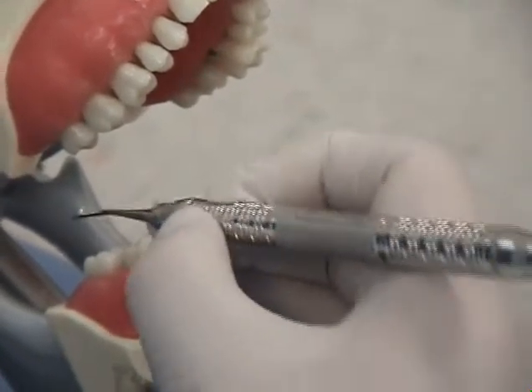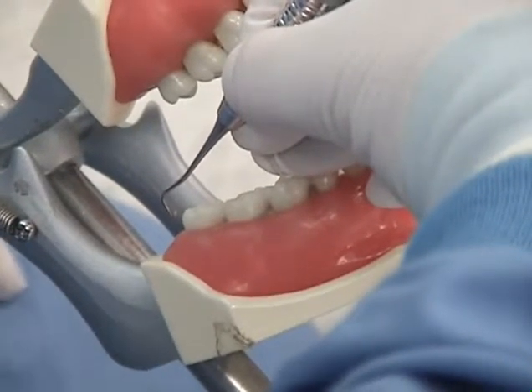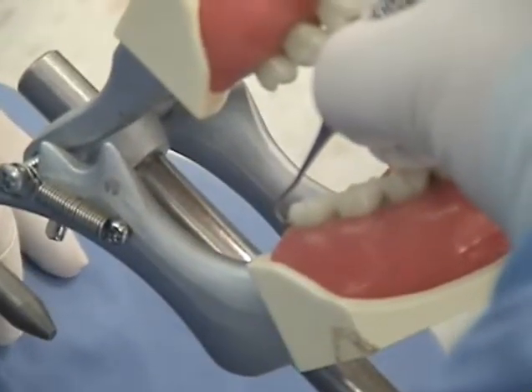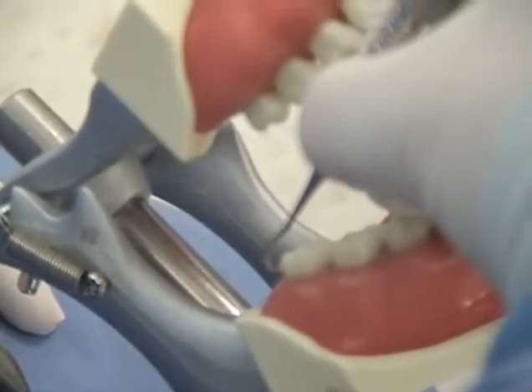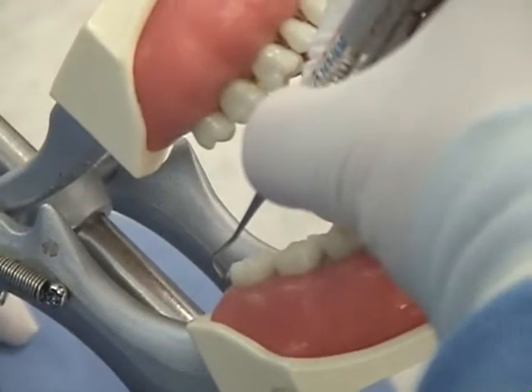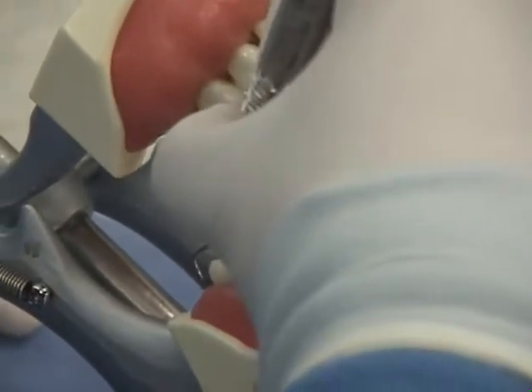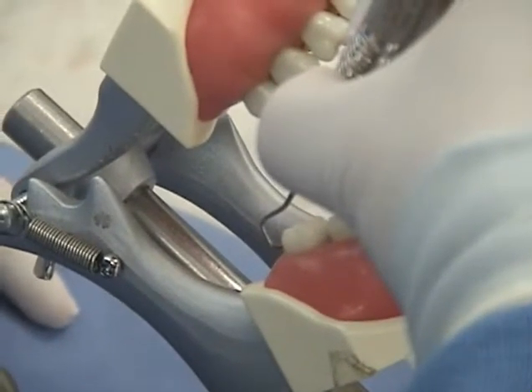Hold the posterior sickle with a modified pen grasp. Begin with the mandibular right posteriormost tooth in the sextant. Establish your fulcrum on the adjacent teeth mesial to your work site. Aim the tip of the instrument toward the distal surface. Tilt the lower shank toward the distal surface until the instrument-to-tooth-surface angulation is between 70 and 80 degrees. Maintain adaptation of the tip third of the cutting edge. Before initiating a calculus removal stroke, press down with your fulcrum finger and apply lateral pressure with the index finger and thumb against the handle. Use a short pull stroke and complete at least halfway across the distal surface.